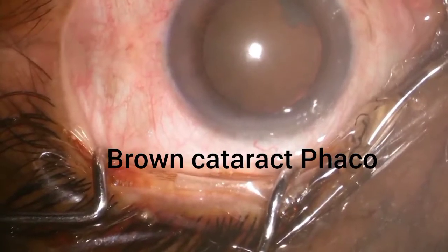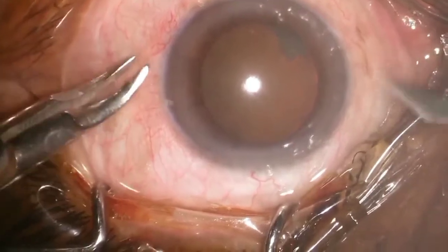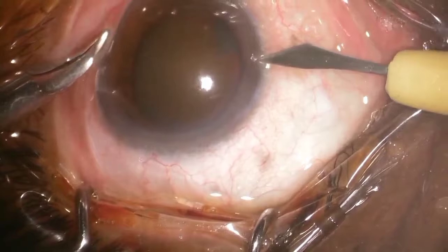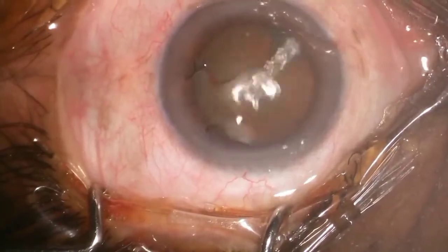Some surgeons have good days in phaco, some surgeons have bad days in phaco, and some surgeons have worse days in phaco. So, this is the video of my phaco surgery of bad days.